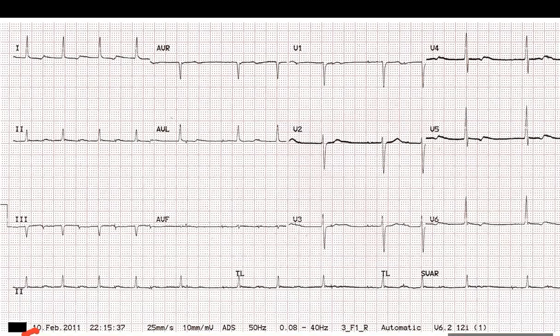But if you see something like this, there is some AV conduction block, so you want to assess why. Are the patients on medication? Are the patients on only a single lead? Do we need to change the device? You should try to figure out why there is Wenckebach. It still could be normal, but that's not the first thing you would say. You would say it's a single chamber device, and then you would see if you need to add another lead or activate the RV lead. Okay.